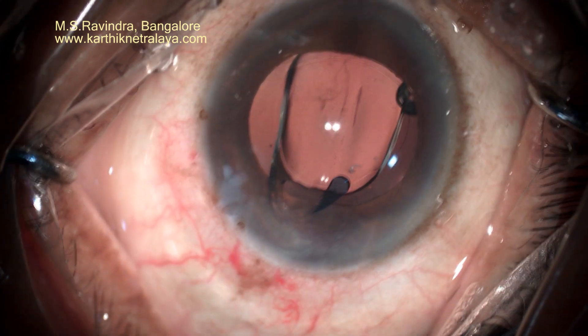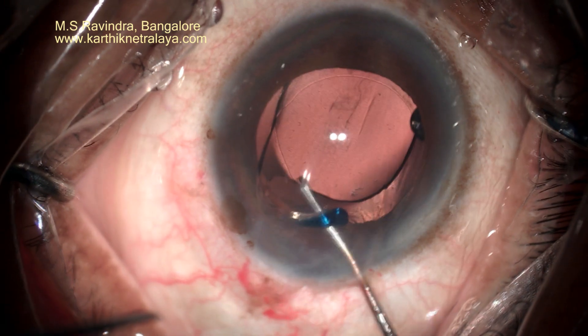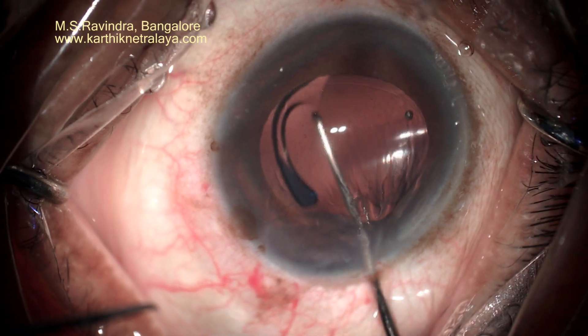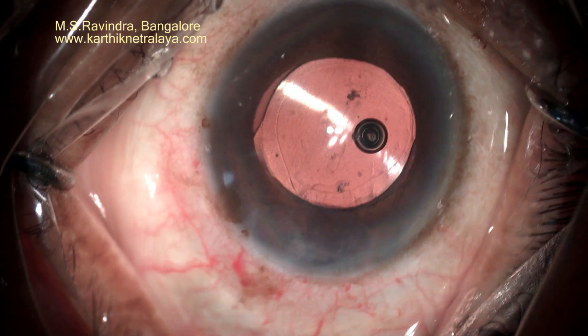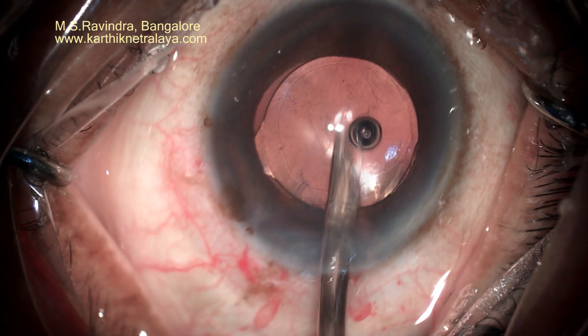It is extremely quick. Results are very gratifying and there is no need for a bandage with topical anesthesia. The lens is centered, and I usually position it in the horizontal axis so that dysphotopsia is minimized.